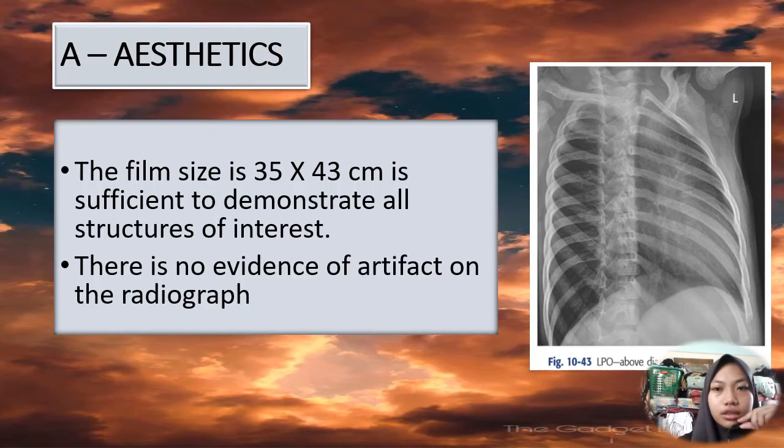For aesthetic, the film size for LPO, 35 by 43, is sufficient to demonstrate all structures of interest. There is no evidence of artifact on the radiograph.